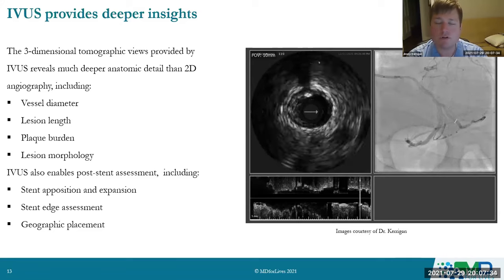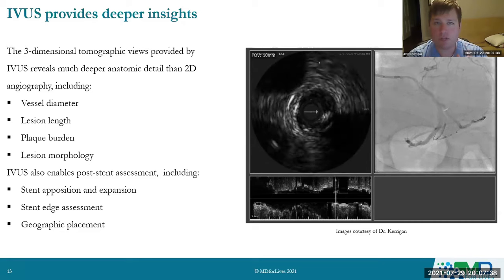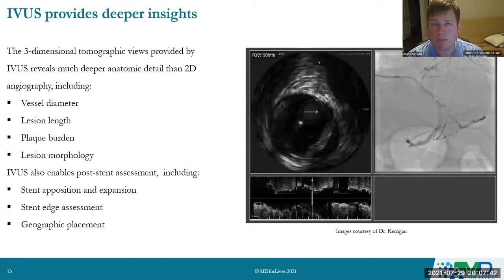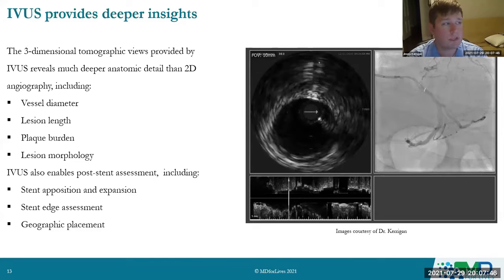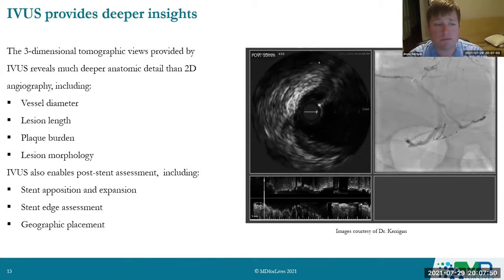Even in a world where we have intravascular lithotripsy, the question is, if I go in with a balloon that's jackhammering the stent open, what's it doing to the polymer and the drug that makes it any better than a bare metal stent? We don't know the answer to that yet. So I still believe, even with the technology we have available, that we really need to get it right the first time.